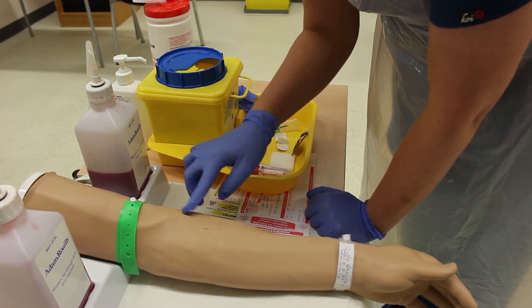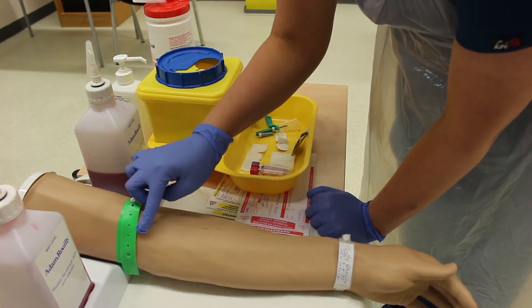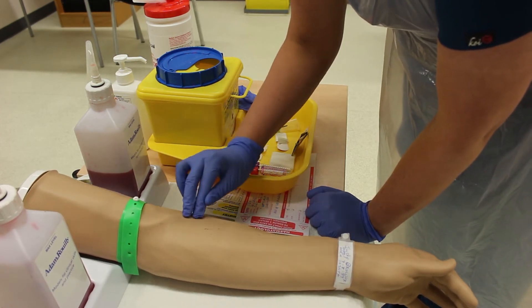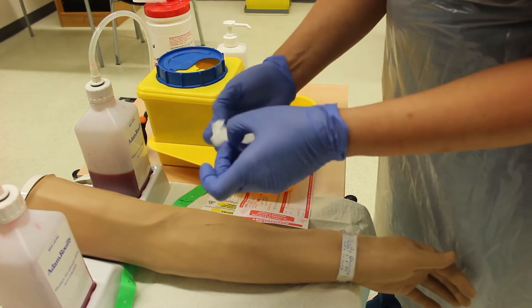I'm palpating the vein, looking for veins that are FREE — firm, round, elastic, and engorged. Follow the journey of the vein and make sure your needle will go in at the correct angle. You don't want to re-palpate once you've cleaned the site, so be sure of where you're going.